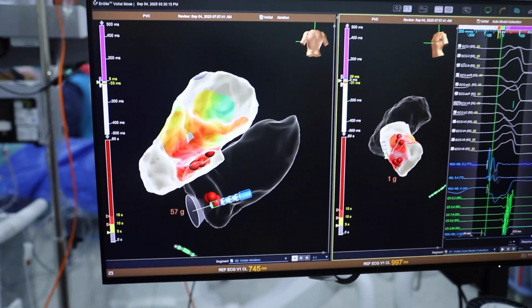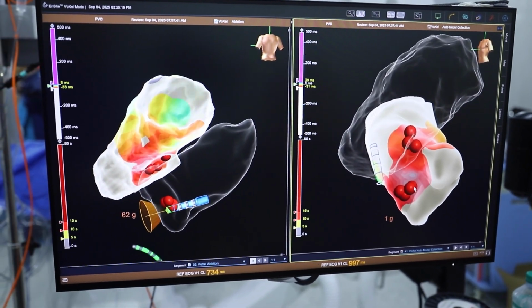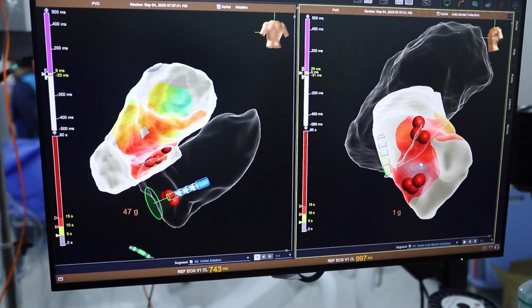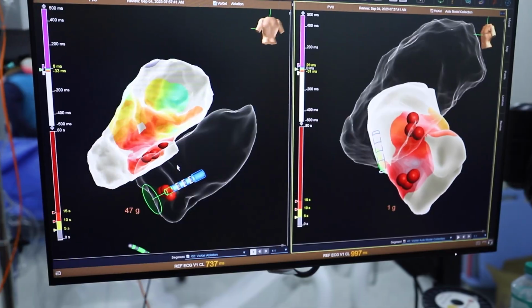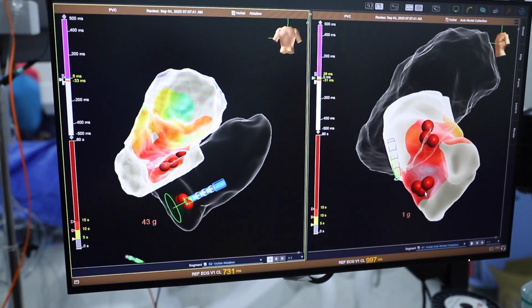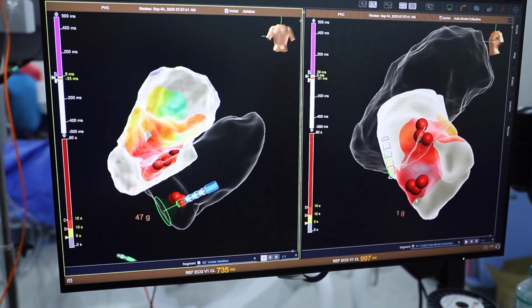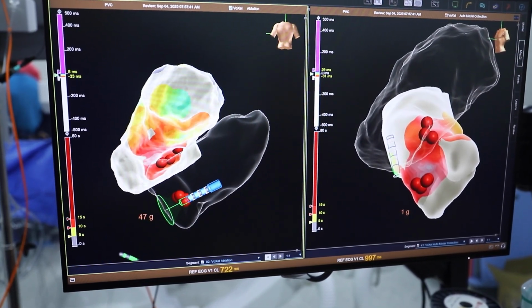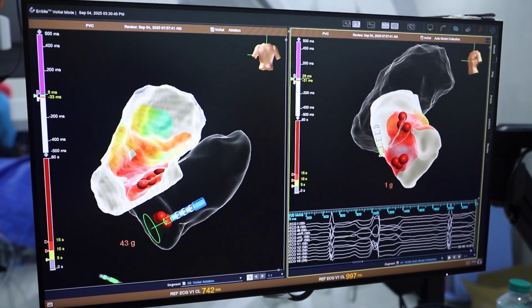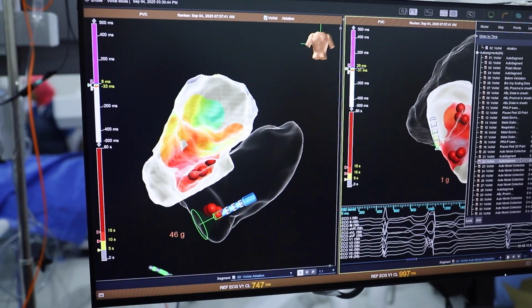This is where we mapped on the left side. We did ablation in this area, and we noticed a delay between the ablation and the disappearance of the PVCs. Can you show us the first ablation, or the ablation which suppressed it? The first lesion. And the tips and tricks. This is the tips and tricks.